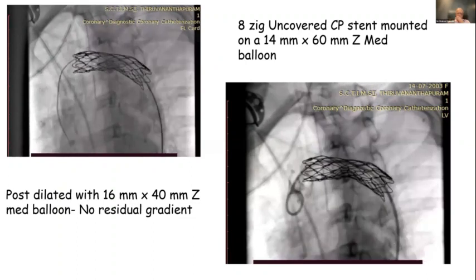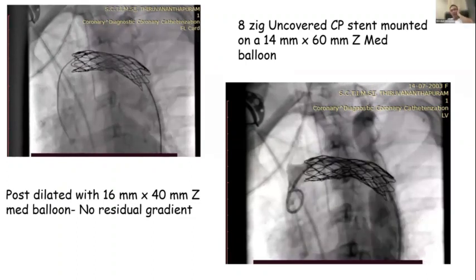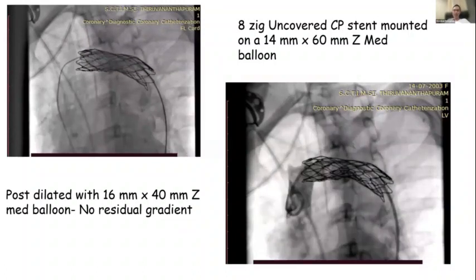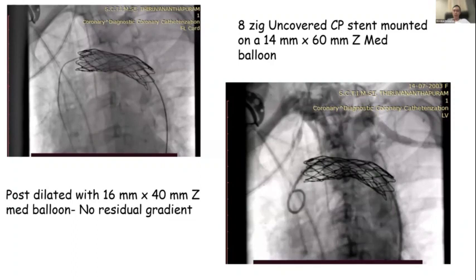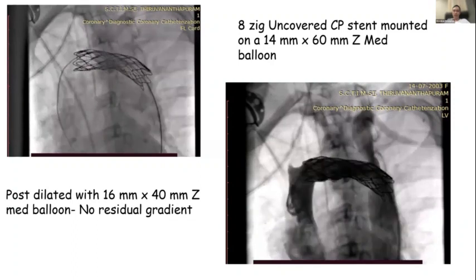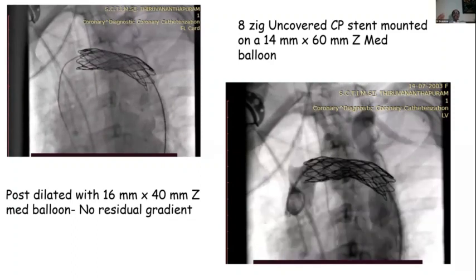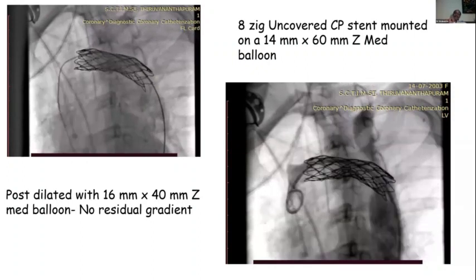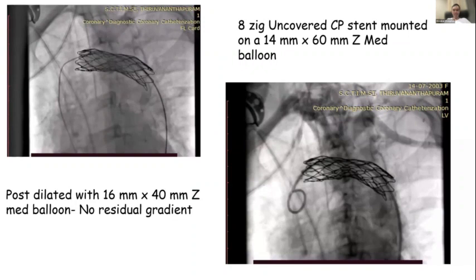So I'm thinking, in this particular case, if we don't have a backup plan, how about surgical bypass? Should we consider this as a first choice? I mean, bypass means what? Ascending aorta to descending aorta jump graft? Yeah, something like that. It's going to be, again, very challenging.